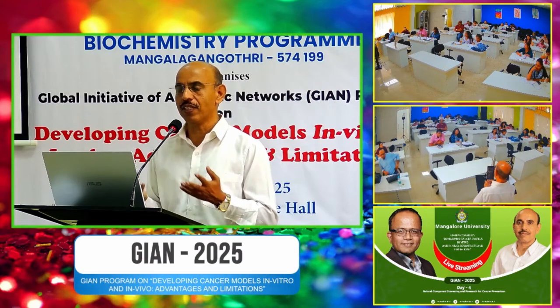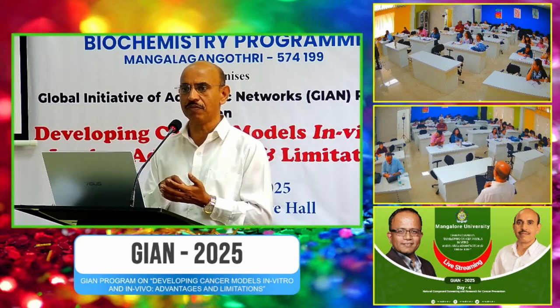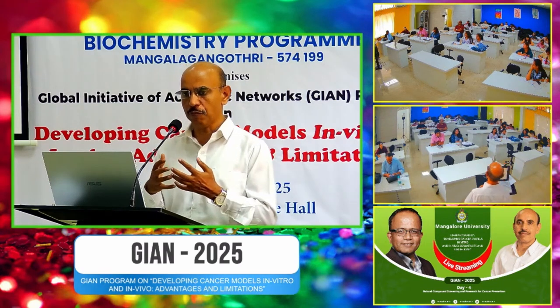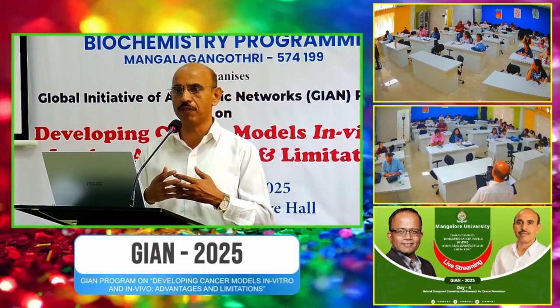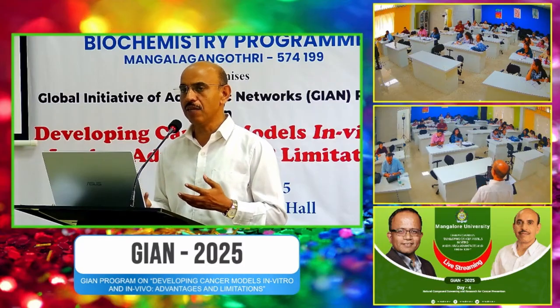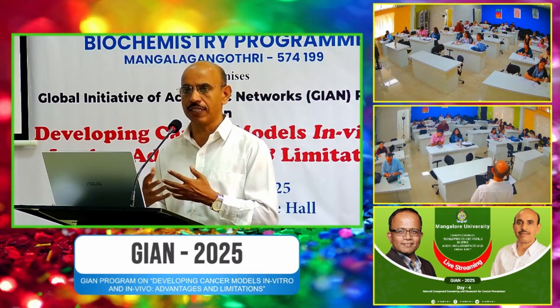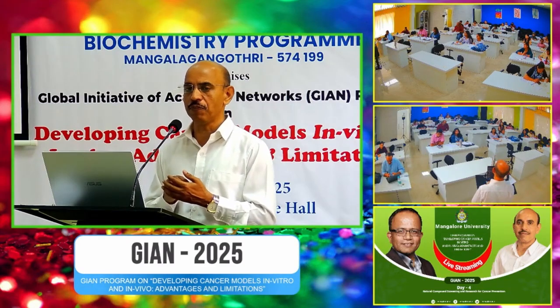That's why fetal bovine serum is rich with various nutrients that are necessary for the cells to grow. There are certain media where you are supposed to provide fetal bovine serum for the growth, like DMEM medium, where you have to provide 10% FBS, or for that matter you may have to use serum regularly for the proper growth of the cell. It depends on the type of the cell you are using, and the type of the media you are using.